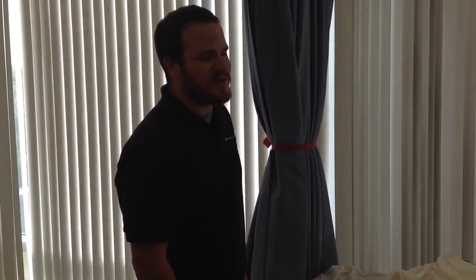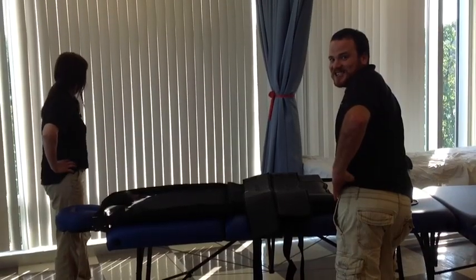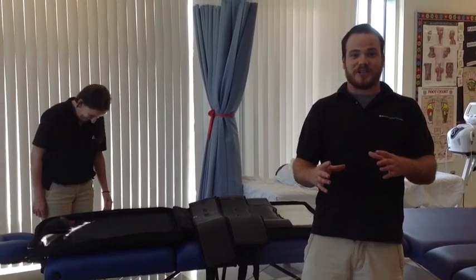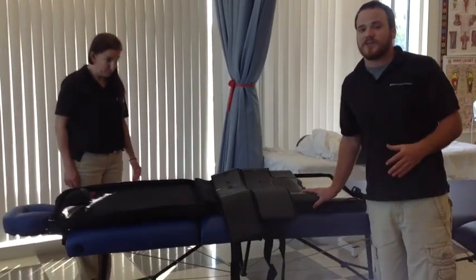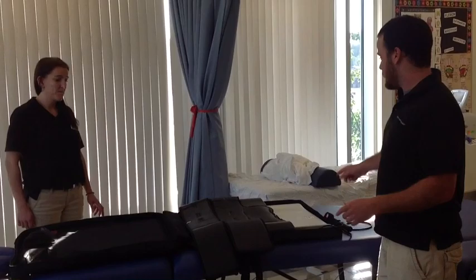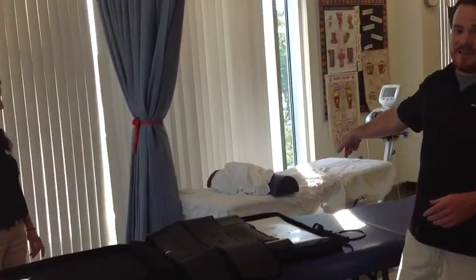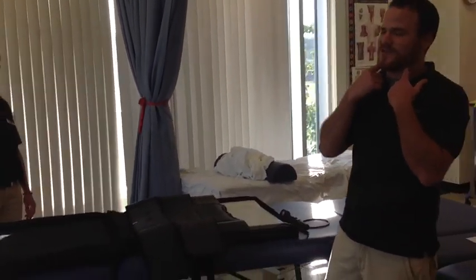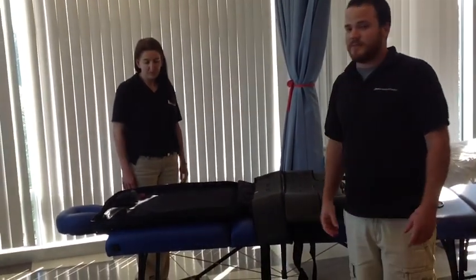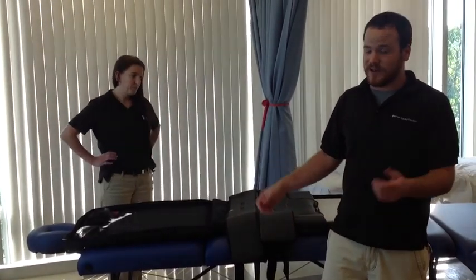Craig feels wonderful after cervical traction. Now let's move on to lumbar traction. We're going to be doing a little bit of lumbar traction using a take-home unit. The other type of unit is the larger machine we just used for the cervical traction. For the sake of time, we're not going to hook Teresa up to that machine — we're going to use this take-home unit instead.